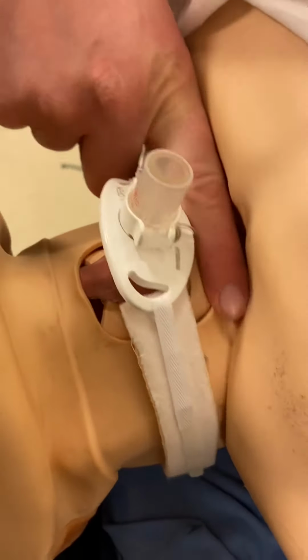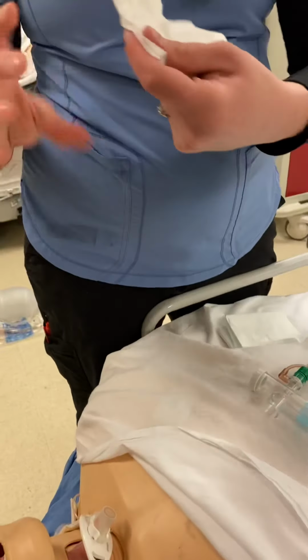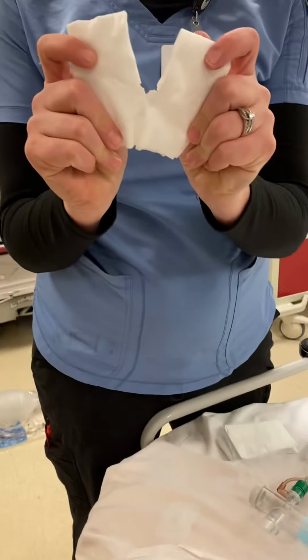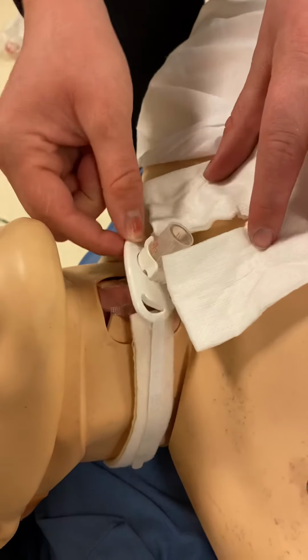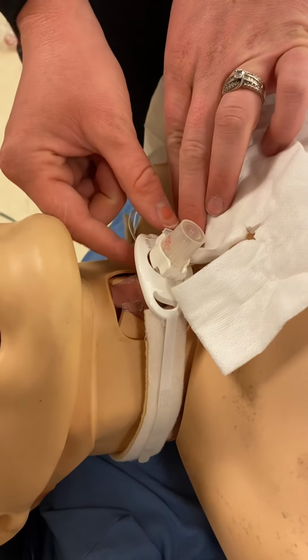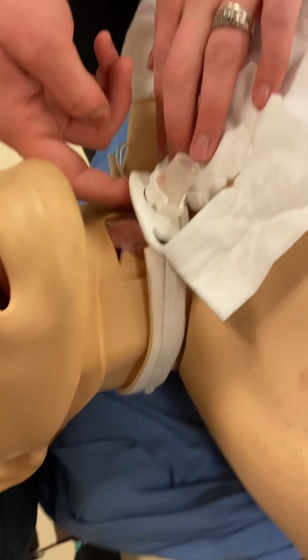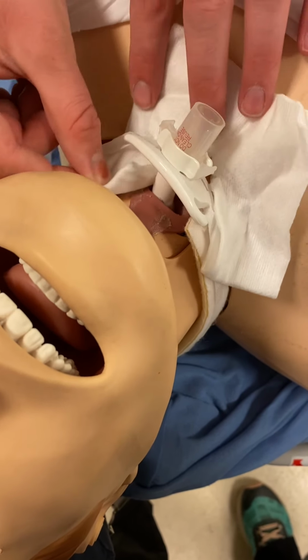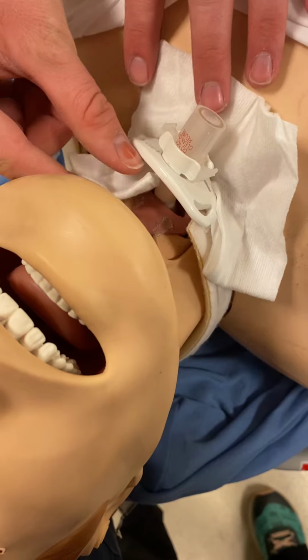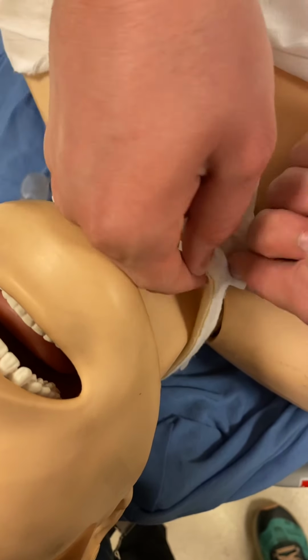Okay, once it's clean and dry, you're then going to take your new fenestrated gauze. It's the one with the hole or the slit down the middle, and you're going to place this around your trach. If it's sutured down or really tight, I recommend getting some curved hemostats to kind of help grab and pull. Also, laying your patient flat or having them tip their chin to the ceiling helps open that airway a little bit, and you're able to get around there easier.